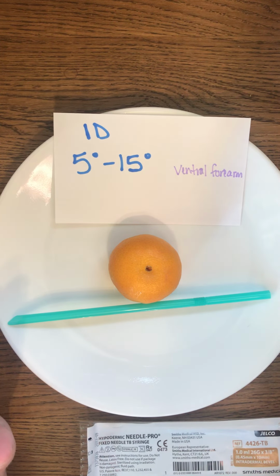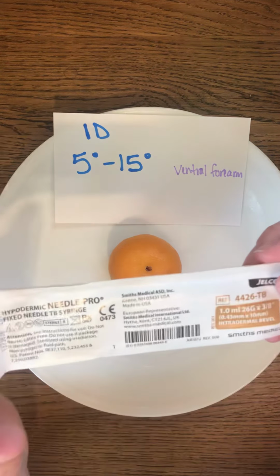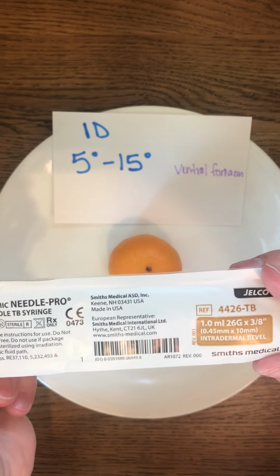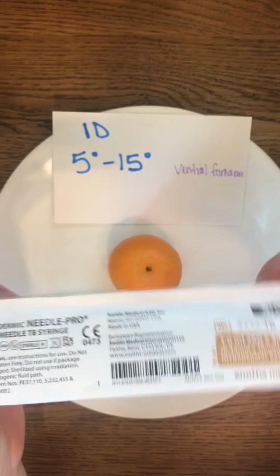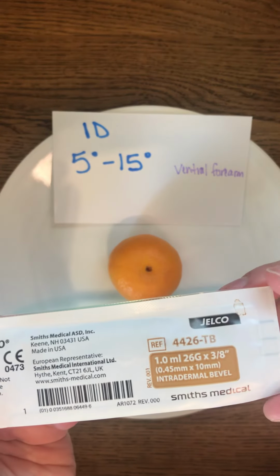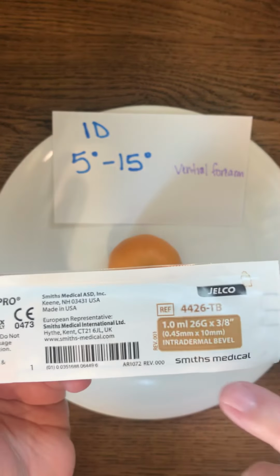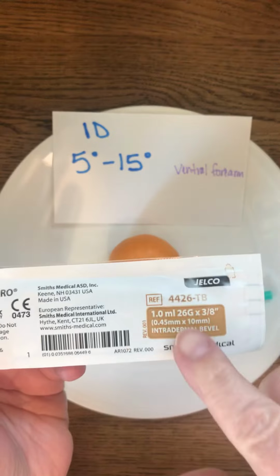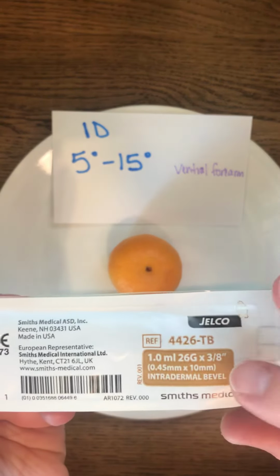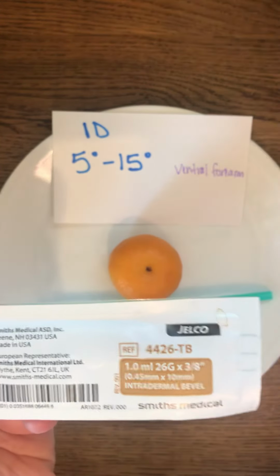that area. So when you're giving an intradermal injection, you are going to want to use a smaller needle or even a tuberculin needle or syringe. Tuberculin kind of looks like this. It's kind of more of the brown. And again, we want to use a very small gauge needle. Remember, the gauge of the needle is like the diameter of the needle. The larger the number, the smaller the needle when we're talking about syringes and injections. So a 26 gauge will work for this.